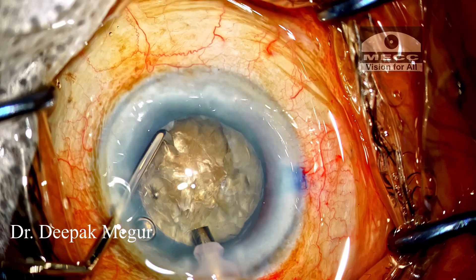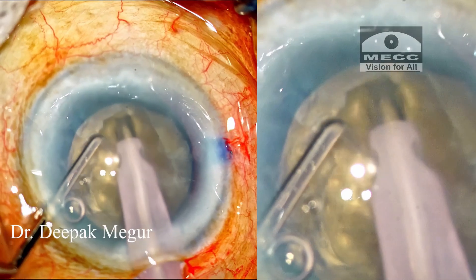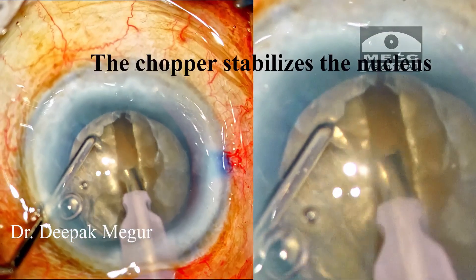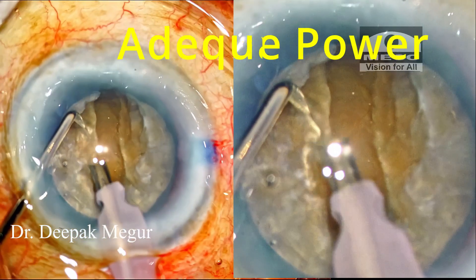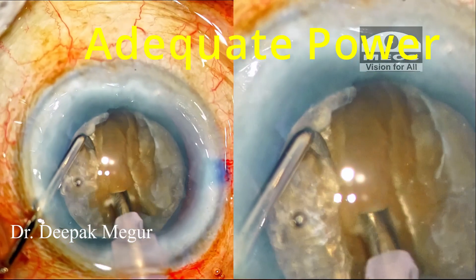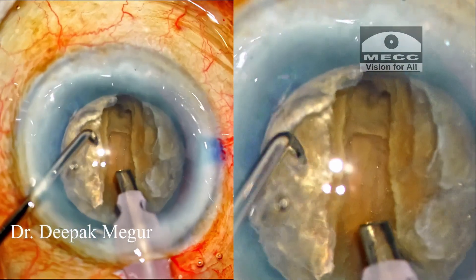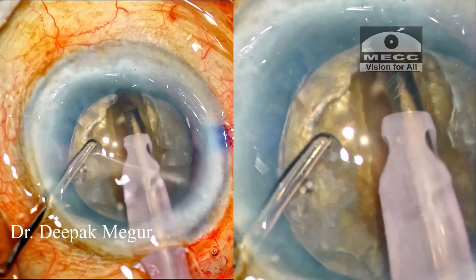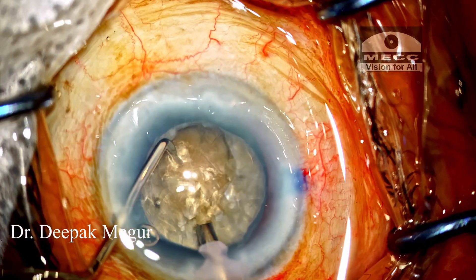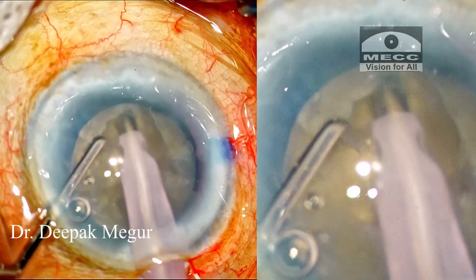So let us now go back and see how we can improve this. This is a similarly dense nucleus, and the first thing I'm doing here is stabilizing the nucleus with my second instrument and using a sufficient amount of energy adequate for this density of the nucleus, so that the tip moves in very easily without pushing the nucleus. In fact, we can see that the nucleus material melts in front of the tip as the tip is moving forward during sculpting. This strategy of stabilizing the nucleus and using adequate power during sculpting causes less stress on the zonules and also on the posterior capsule.